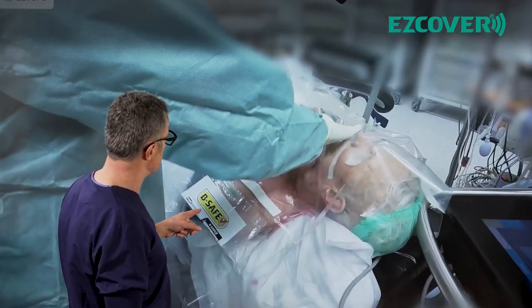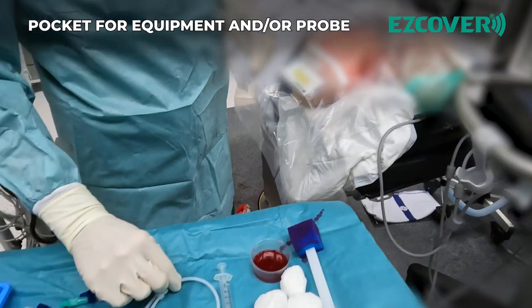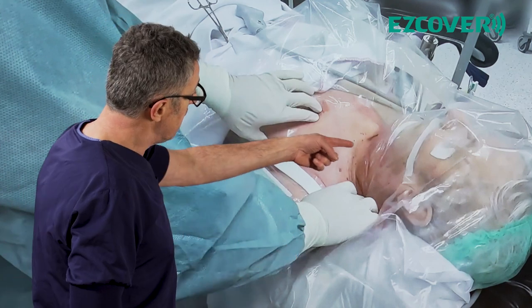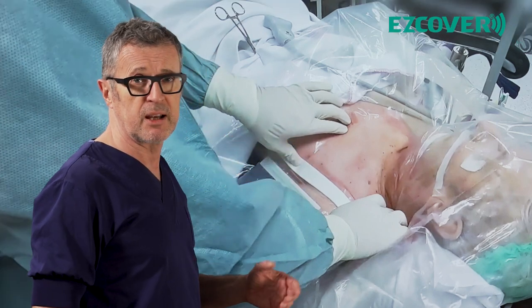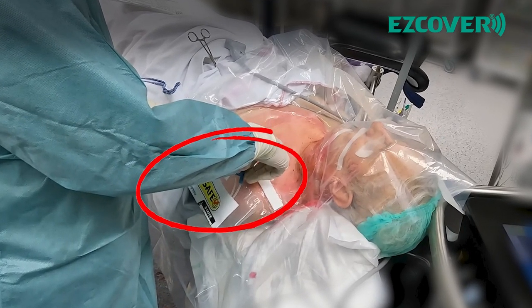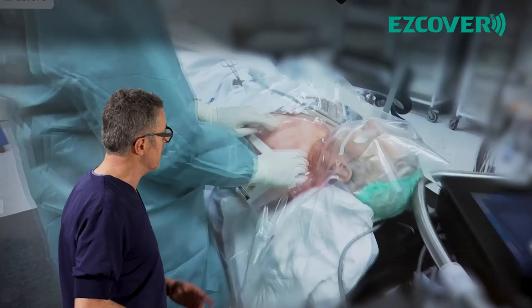This pocket is extremely useful because once you get access to the subclavian vein with your needle you don't really want to move away or reach far to the tray for your guide wire. Your guide wire should be right there at your fingertips in order not to have the needle dislodged. That's one of the most common mistakes — people get inside the subclavian vein and by the time they reach out to the guide wire they may lose the position of the needle tip inside the vein.